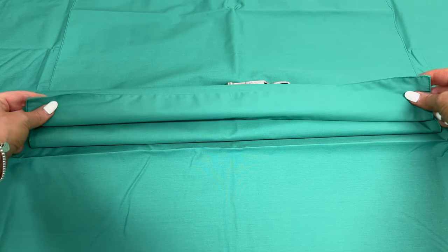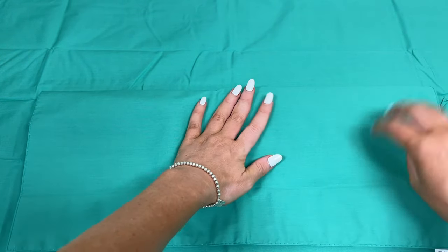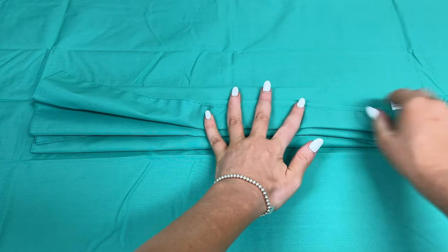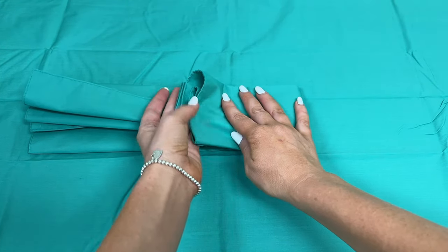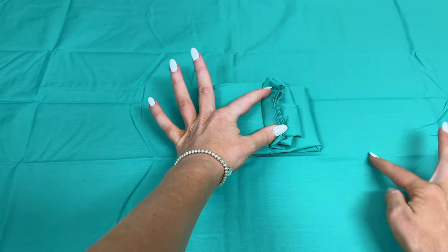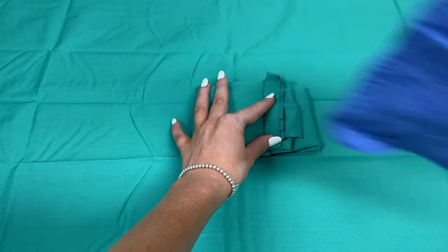Now we're going to start our concertina wrap. Concertina is just a folding back and forth. I always place my hand over the center of the kit when I'm going back and forth with the concertina — back towards me, back again, and then towards me. The concertina fold is kind of like an accordion — it folds back and forth on itself. This makes it easy for when the surgeon opens up the kit to grab the edges and it kind of unfolds all outwards.